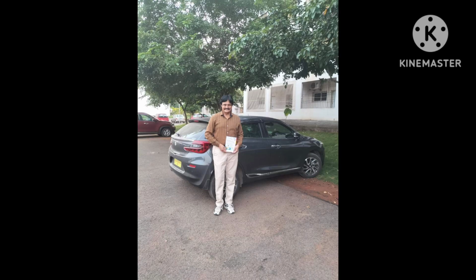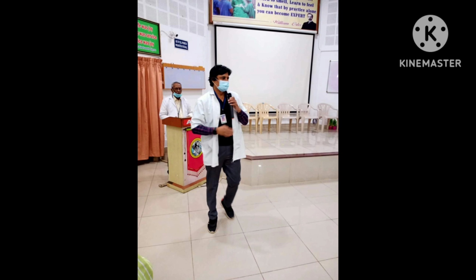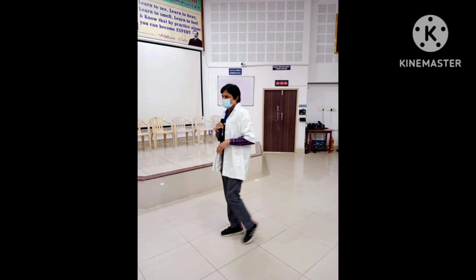Can it be used in cardiogenic shock? Yes, cardiogenic shock following acute myocardial infarction was the main indication for the IABP. However, recent trials have caused a slight decline in its routine use.